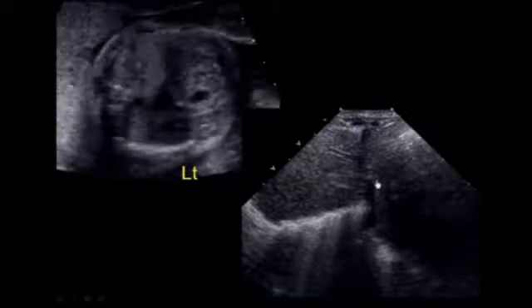Another patient with a diaphragmatic hernia, the heart is pushed to the left and we see a lot of bowel in the front and a solid appearing structure here in the back, wondering what that could be. Well, postnatally, we scanned the newborn and we can see that this is a big piece of liver, and the hole in the diaphragm is right here, and you can see the liver has protruded up into the chest, and here's the aerated lung around the edge of the liver.